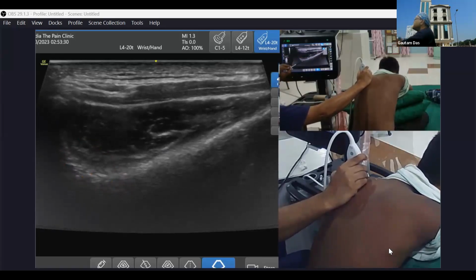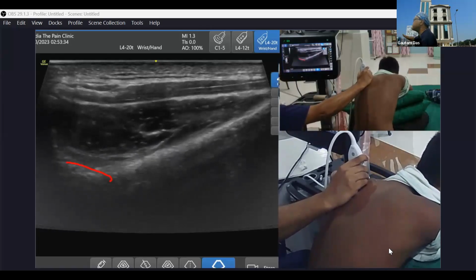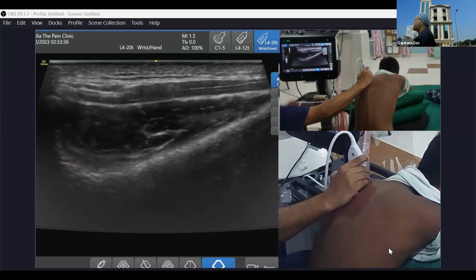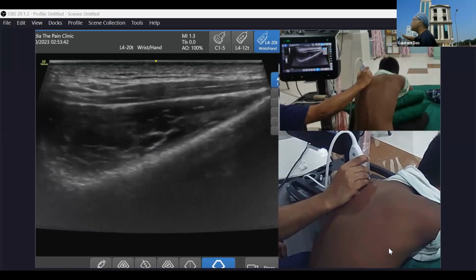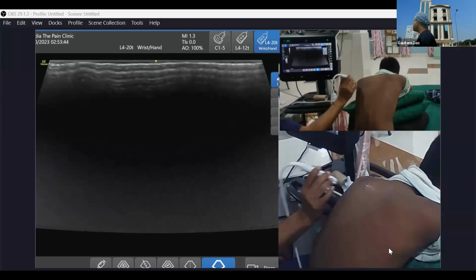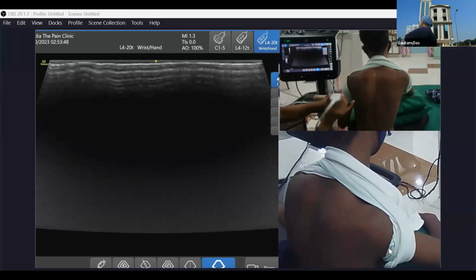And there is a ligament there. Most of the time the nerve is below that ligament, or sometimes above the ligament also. So classically the suprascapular nerve block can be done there, but as I told you, nowadays we don't prefer it. Nowadays we prefer to block here.